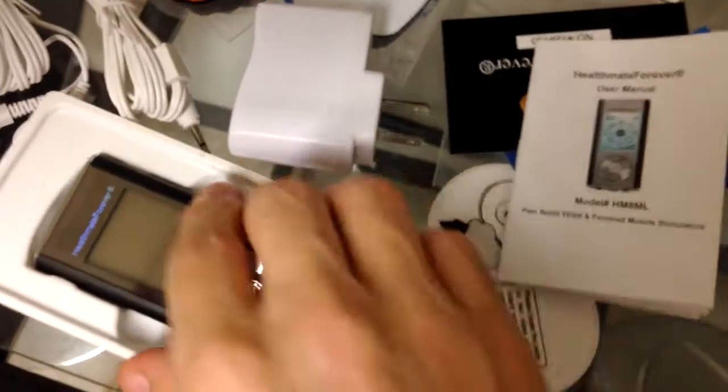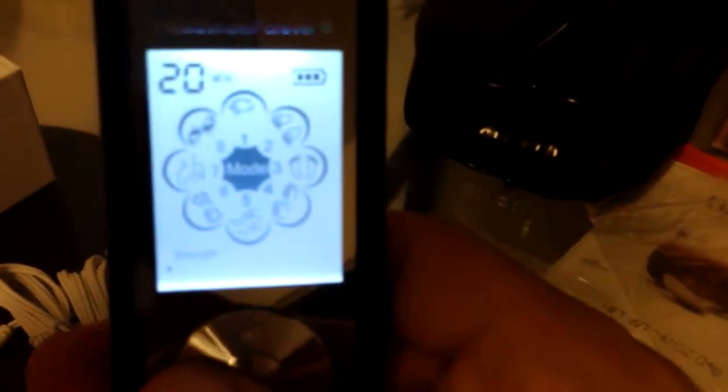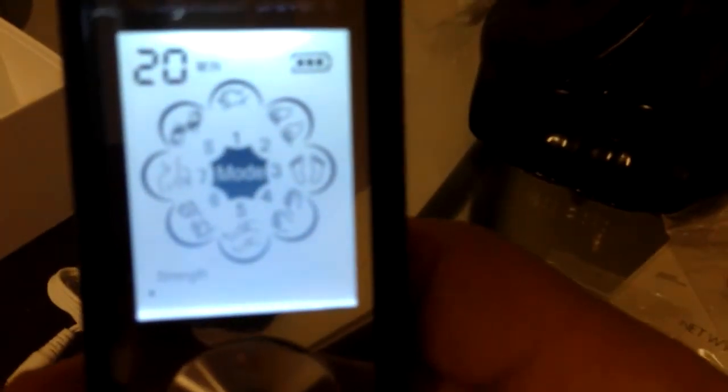If you guys didn't see that screen clear enough I'll show it to you again — so that's what it looks like. The first setting there will be the hands going up and down, and then the second one — which I'll try — I'm gonna try to use the second setting.